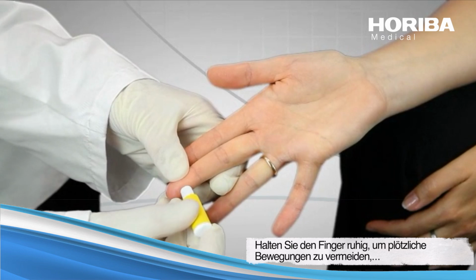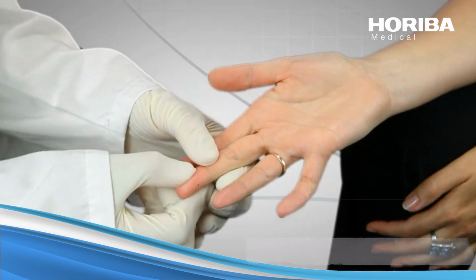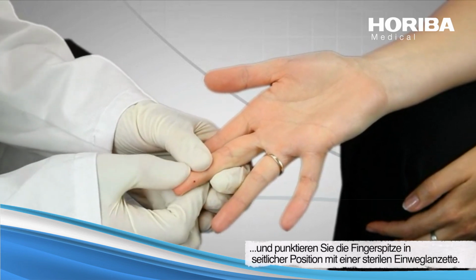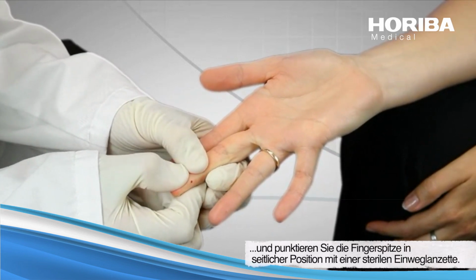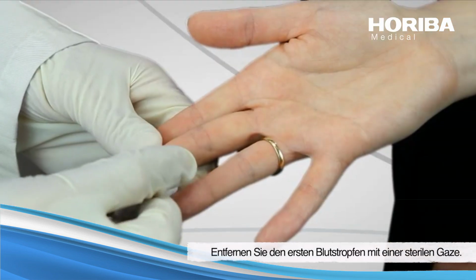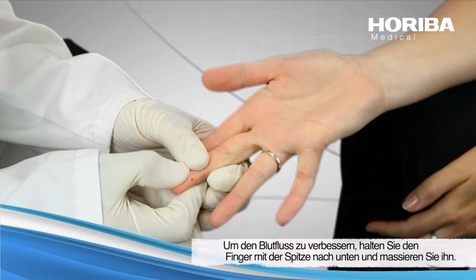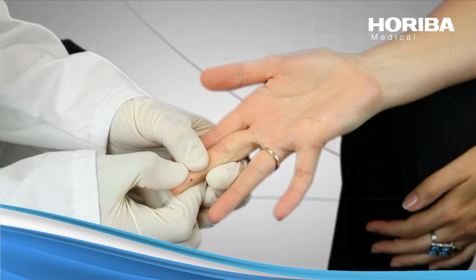Keep the finger still to prevent sudden movement and puncture the tip of the finger in a lateral position using a sterile disposable lancet with a retractable point. Remove the first drop of blood with the sterile gauze. To improve the flow of blood, keep the finger pointing down and massage it.